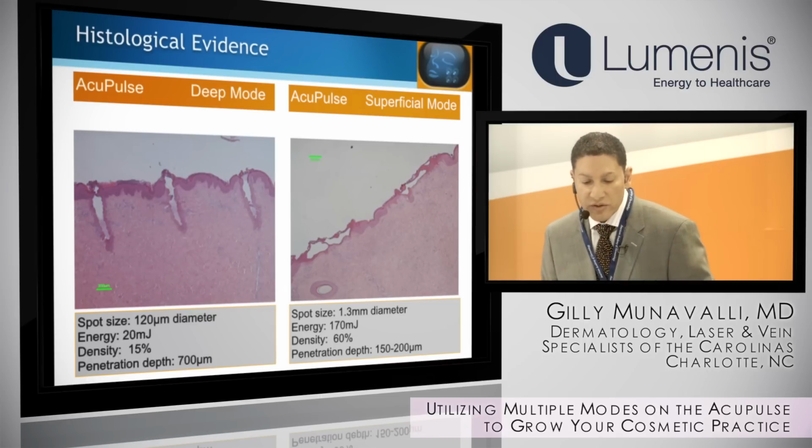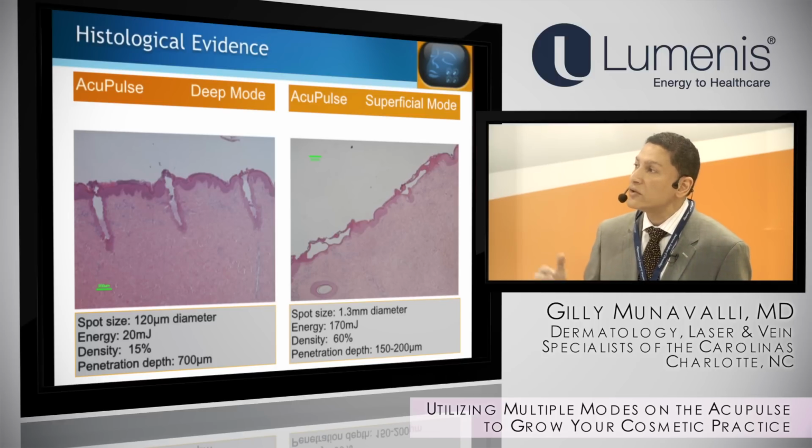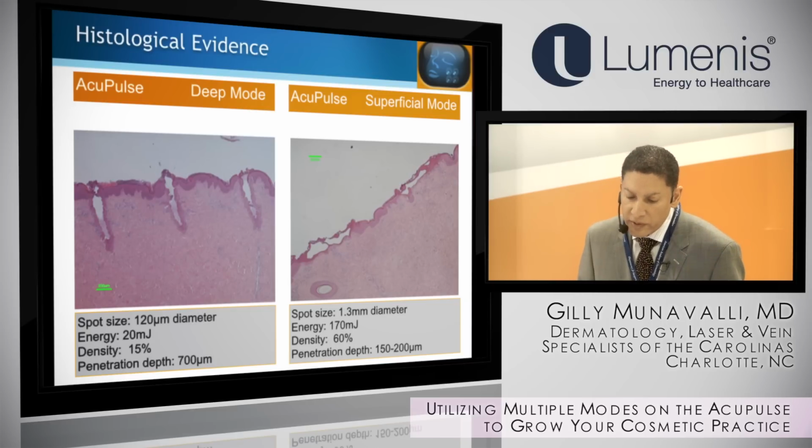This is some of the histology that we did, showing the deep and superficial modes. I explain to patients why we need to use a combination laser, because they have dermal lesions, which are wrinkles, and epidermal lesions, which is the photoaging and epidermal changes.